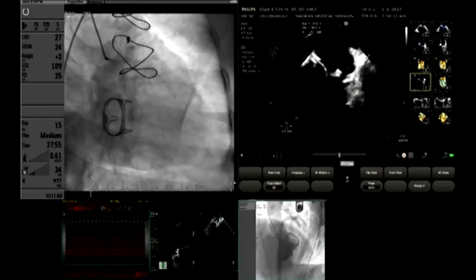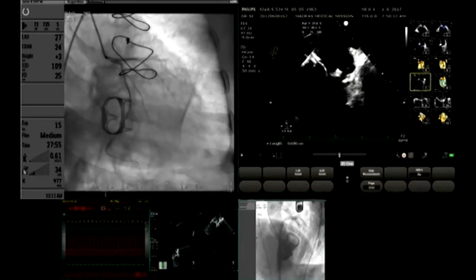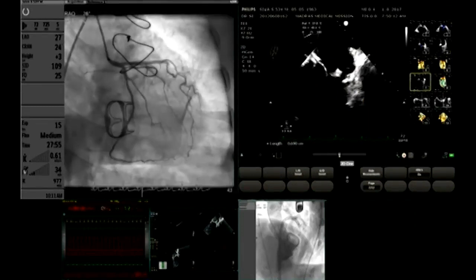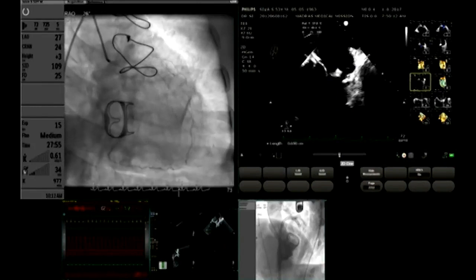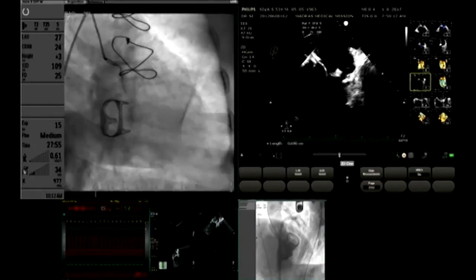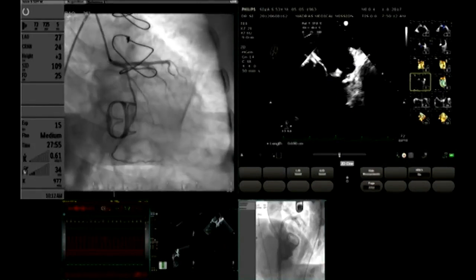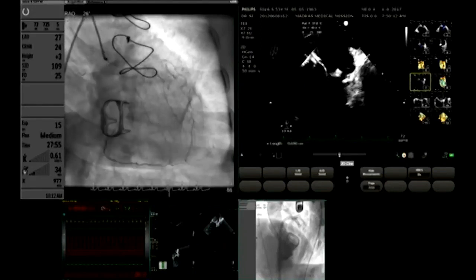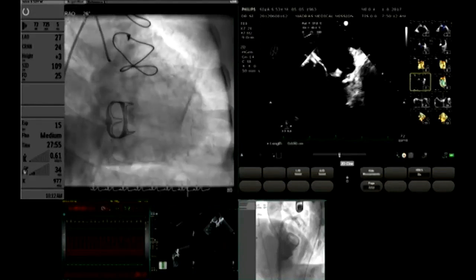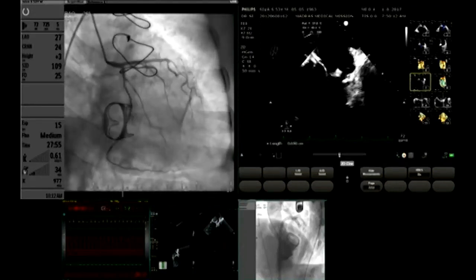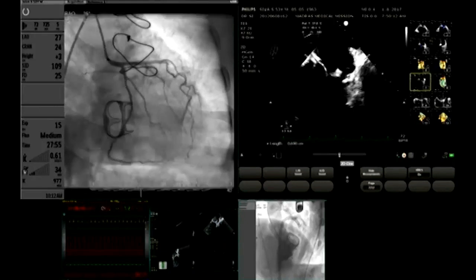At this time let me show the angiogram. I have with me Dr. Ramya — we are both doing the procedure — and Dr. Sreeja is at the echocardiography. These procedures are primarily guided by echocardiography, especially 3D transoesophageal echo, and Dr. Sreeja is at the echo end.